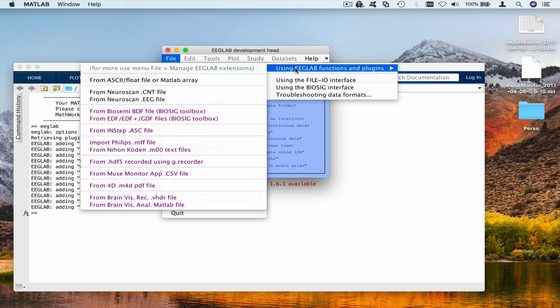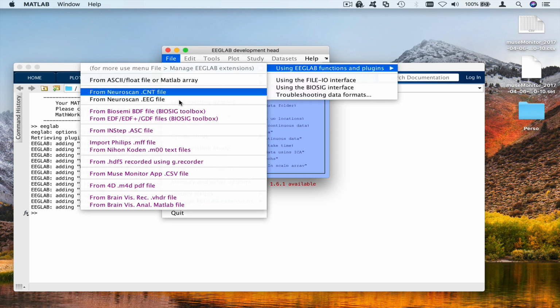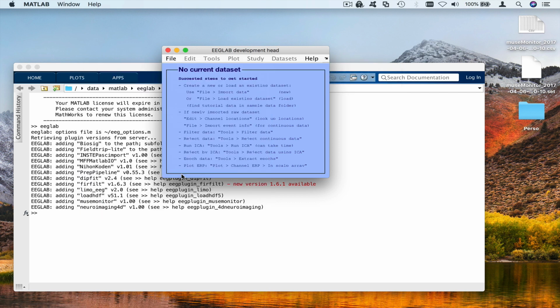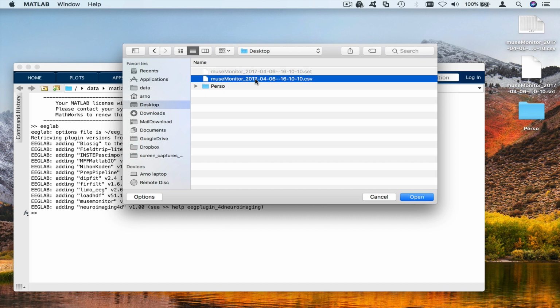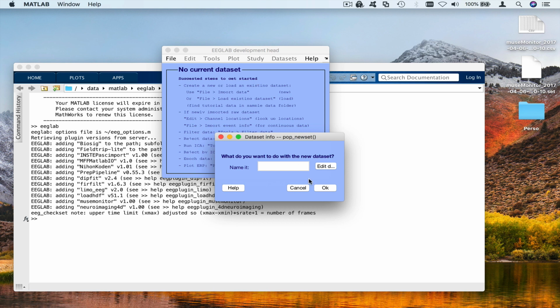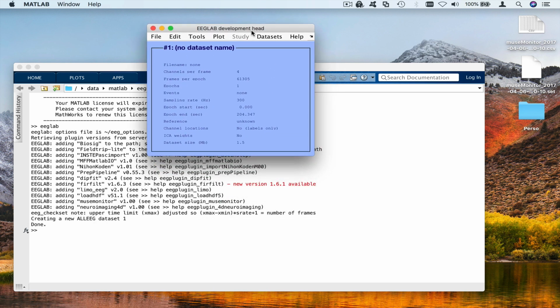So you go into the menu File, Import using EEGLAB functions and plugin, and then you select Muse Monitor apps.csv file. I have one on the desktop, which I'm going to select. You don't need to set a name. Here it is. Now it's imported in EEGLAB. It says 4 channels, number of frame, 204 seconds.